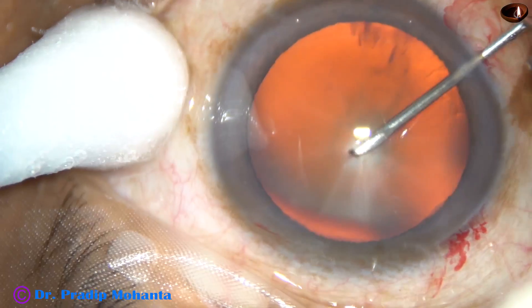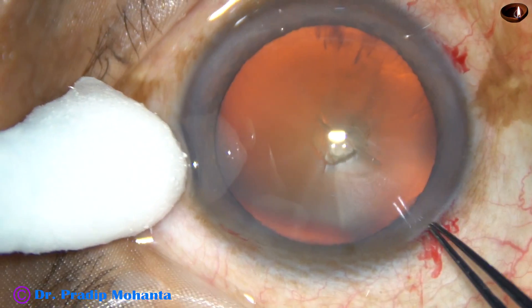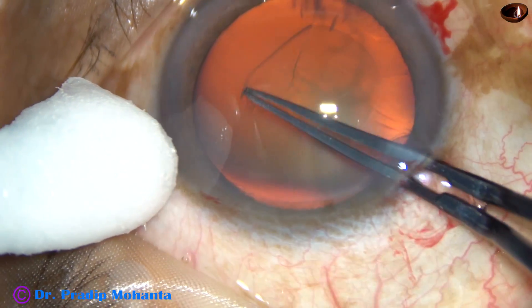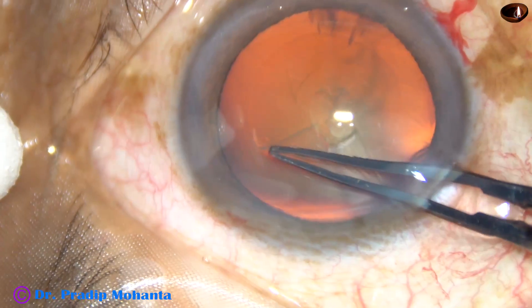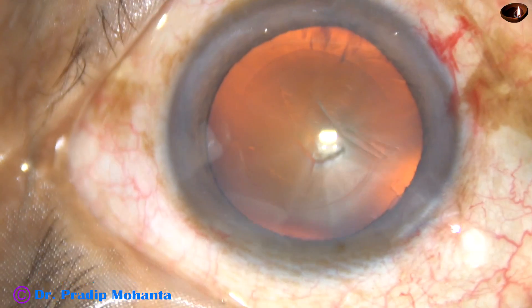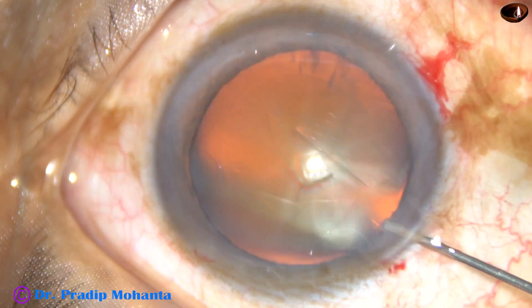Capsulorhexis. The anterior capsule is incised with a 26 gauge bent needle. And with the help of the utrata forceps, I am going anti-clockwise and doing this continuous curvilinear capsulorhexis. Red glow is very good and you can see the rhexis margin quite well.